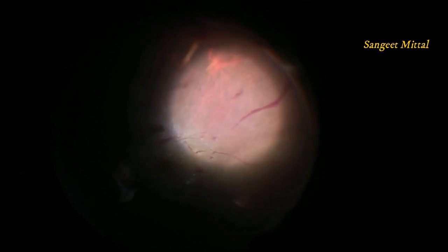This was another patient with vitreous hemorrhage and TRD. A thorough vitrectomy was done. Vitreous was shaved up to the base. A streak of peripheral pre-retinal blood was seen. On applying suction at this blood streak, vitreous membrane was separated from the retina. This membrane is quite adherent to retina and requires some effort to peel it up. The peeling has to be done from anterior to posterior rather than posterior to anterior.